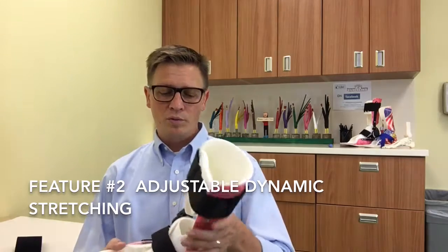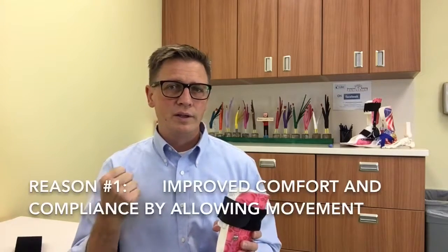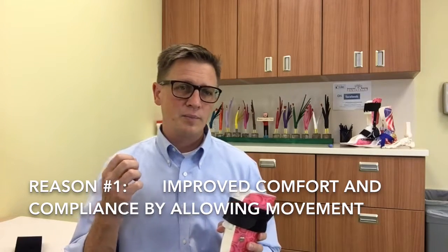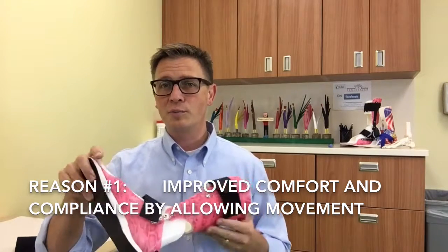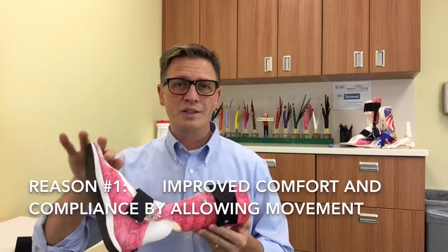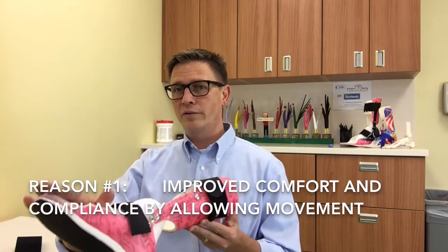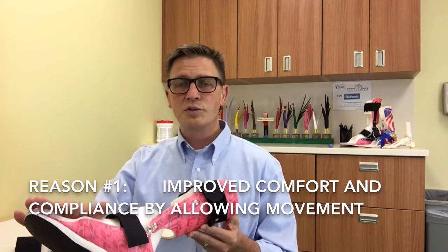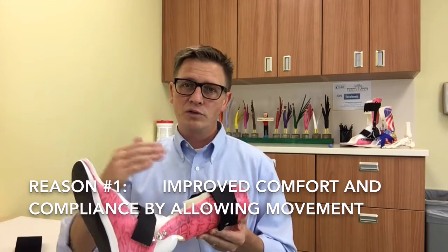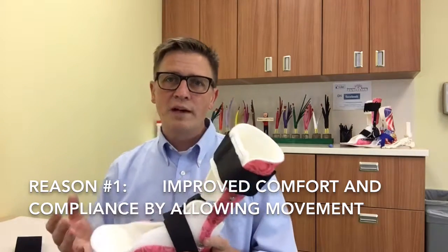The second thing that's important is we want to have adjustable tension, and so we use dynamic bracing for two reasons. The first is so that if a child is sleeping and rolls over and feels the need to move, stretch, or push, or if they have spasticity, the dynamic bracing allows that to occur — when they're active or their tone is active they have that release, and when they relax again the tension comes back and provides that dynamic stretch.